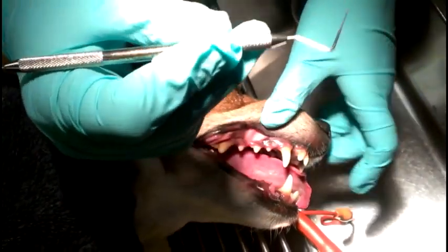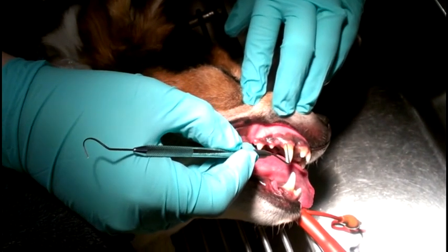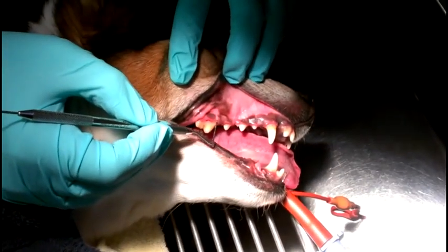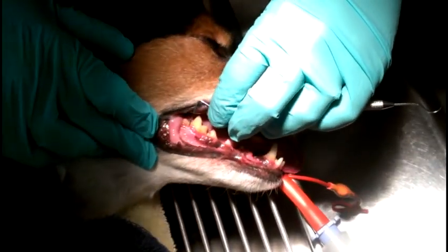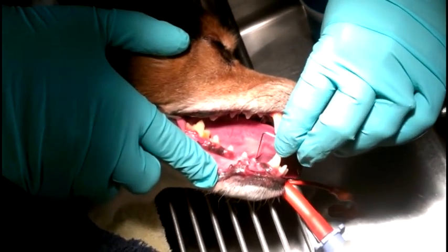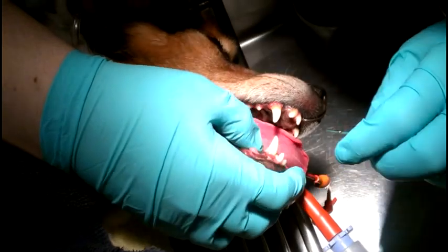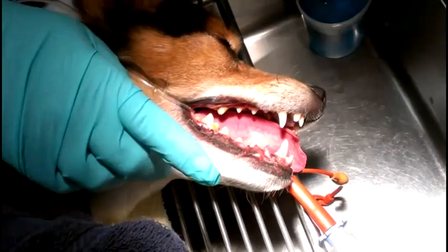So what we're going to do is we have a dental probe, and we're just going to check around her teeth to make sure that there's no pockets, meaning that the probe goes way up under the gum line. That would indicate some dental disease that we need to check out further. She's got a lot of tartar on these teeth. All the gums so far look nice and healthy. I don't see any loose teeth, which is good.